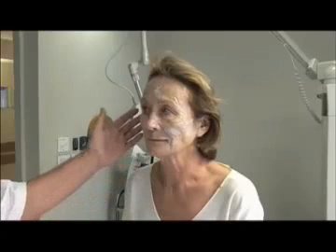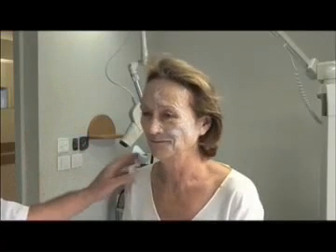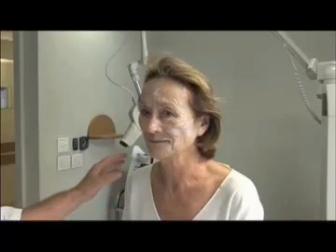This is a sun-induced dermatosis, as we can see, that we're going to treat with a CO2 laser. This is a sun-induced dermatosis in a reformed smoker. Heavy smoking is a contraindication to CO2 laser treatment, but this is not an issue as the patient stopped years previously, therefore this is not an issue.